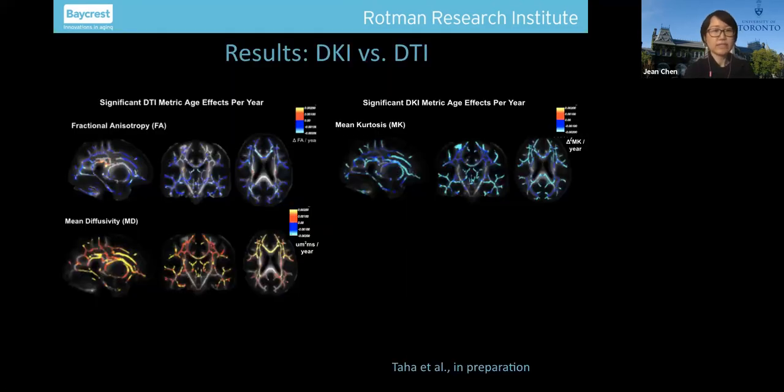First, to show the DTI measures, these are kurtosis corrected DTI measures, and they look very similar to the ones we saw before. You still see this general decrease in anisotropy as age progresses, and you do see this mean diffusivity increase, and you do see this higher fractional anisotropy in the older populations in this internal capsule region.